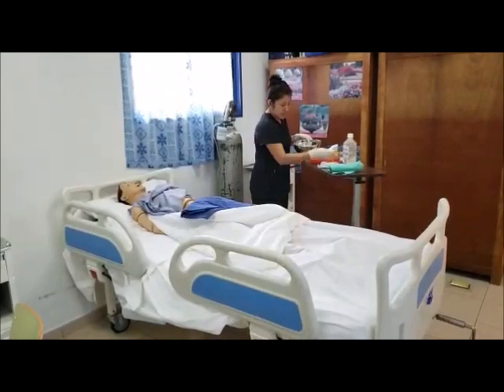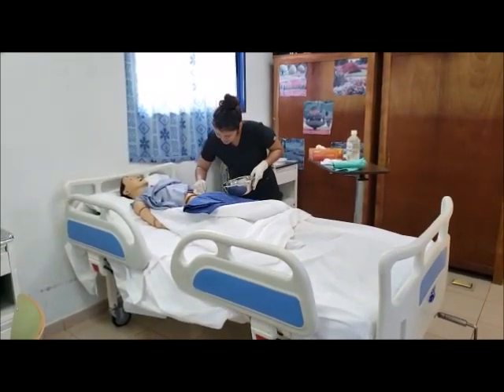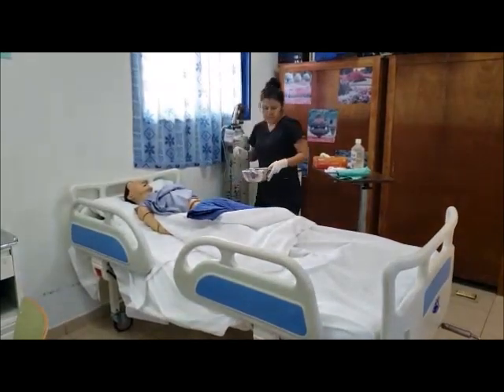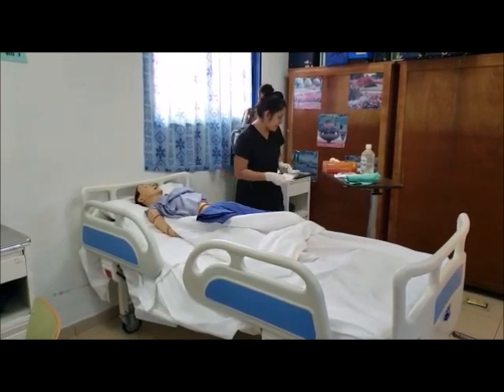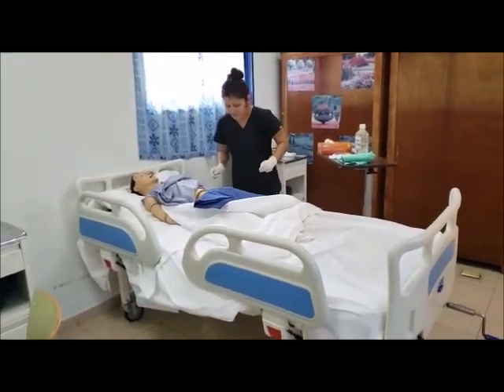Okay, Mr. James, I'm going to be cleaning your stoma. Skin is dried with soft cloth. Tissue is kept available in case of stoma function while pouch is off. Okay, Mr. James, everything looks good.